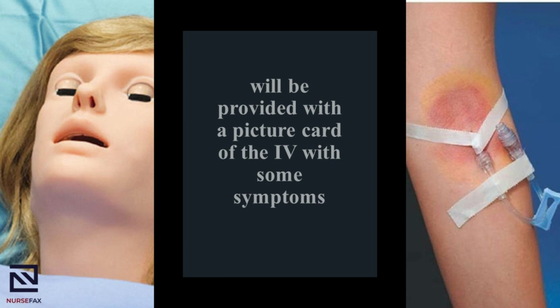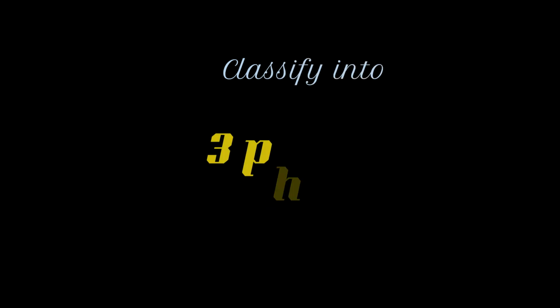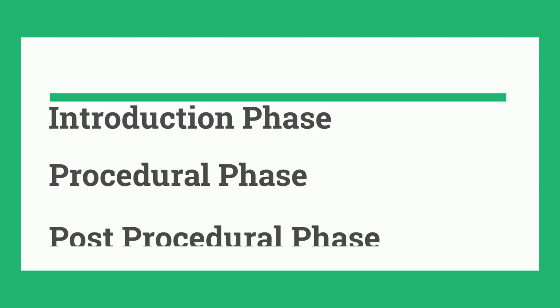You will perform this station on a mannequin hand and you will be provided with a picture card of the IV with some symptoms. The allowed time for the station is 12 minutes. This station can be classified into 3 phases, which are: Introduction phase, Procedural phase, Post-procedural phase.